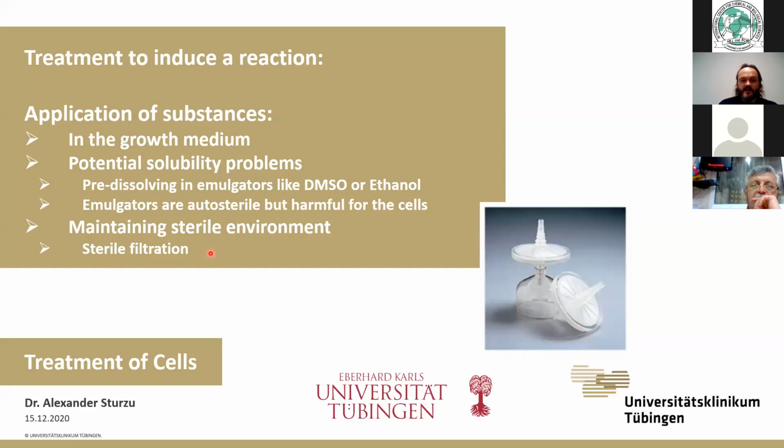However, because they are auto-sterile, they will kill all the bacteria that grow in them. They will have the same toxic effects on your cells. So you have to be mindful that you need to dilute them very much so you don't have an adverse effect on your cells. And if you're running studies with compounds that you have pre-dissolved in these emulgators, be aware that you need to run a control of cells that are only treated with these emulgators at the same concentration to exclude any effect of these emulgators on your cell culture.